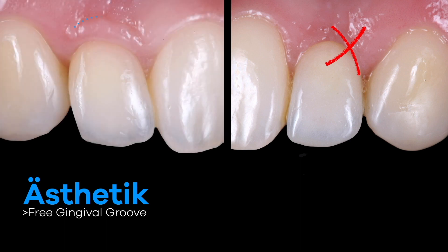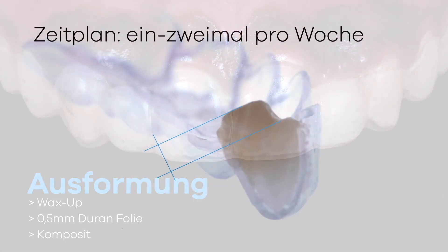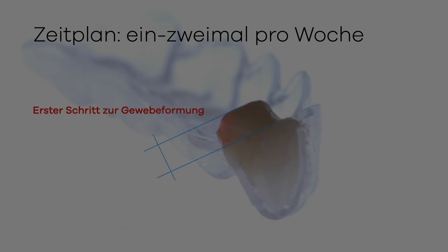We have now determined the goal of creating a free gingival groove in the ovate pontic molding. The shaping is created using a 0.5 mm Duran foil, which is manufactured according to a wax-up template and filled with composite. The systematic shaping to the ovate pontic is done step by step.